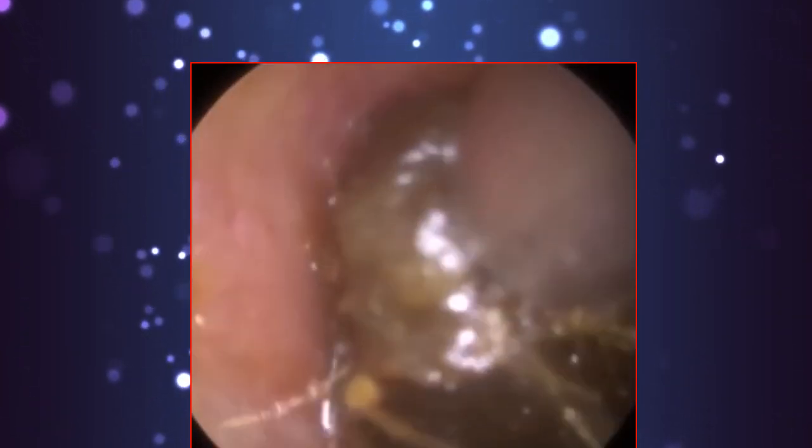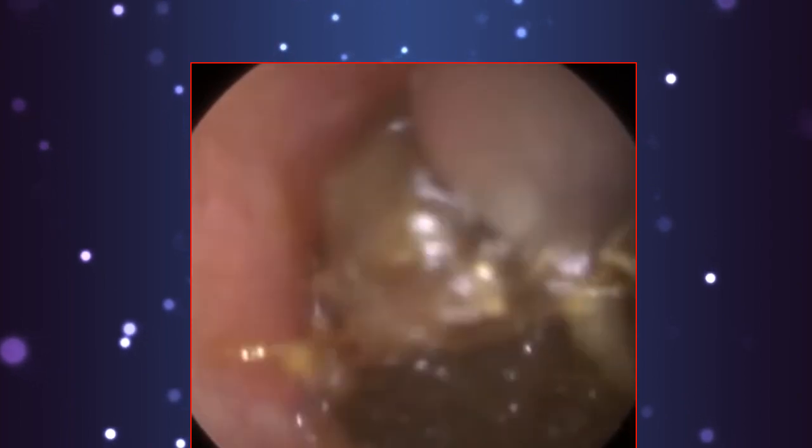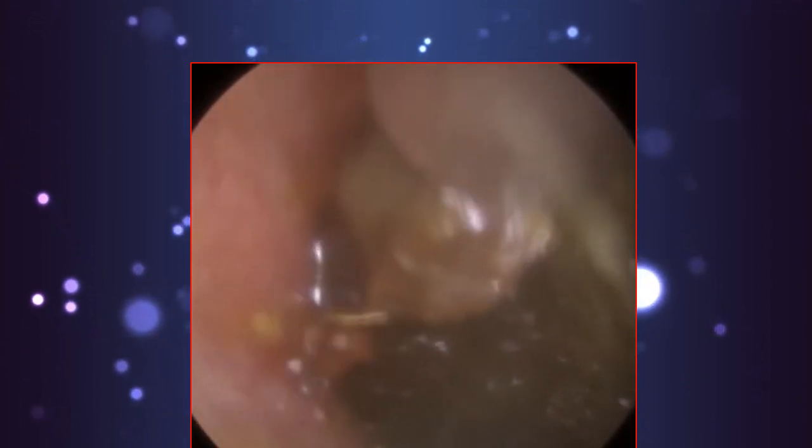Now we can't really use any of the instrumentation to remove this. So when we're on the bony part of the ear canal, very close to the eardrum, if I was to use an ear hook, the plug itself is too soft. It will just dissect it. And how am I going to get this hook in and behind the wax? It's completely impacted against the canal walls. There's no natural opening.